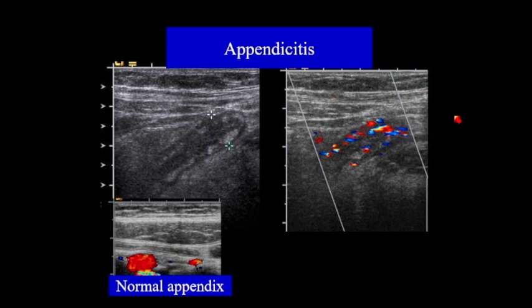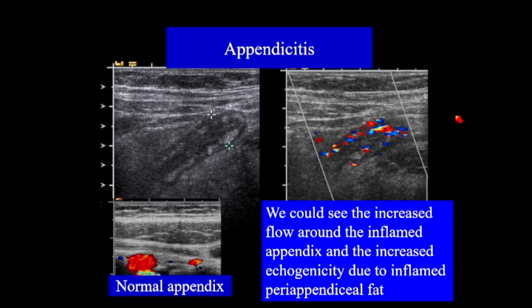This is just an example of a normal appendix, which, if you try to find, you will find much more often than I originally thought. You can use the cecum to help guide you.